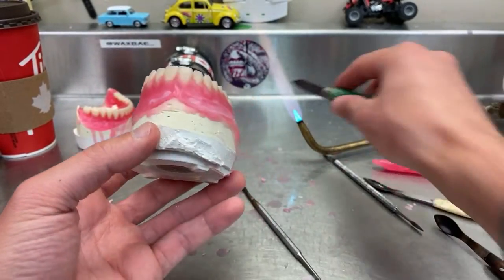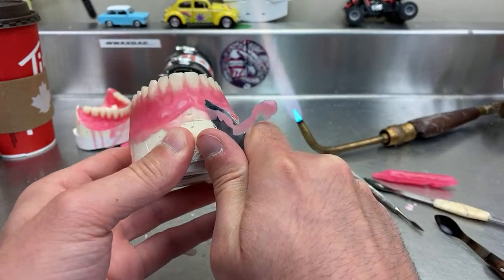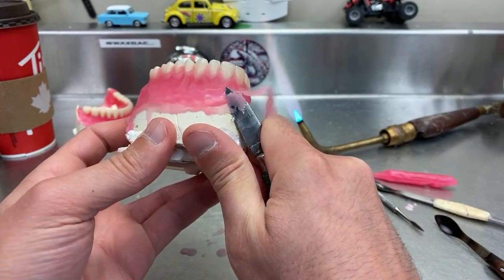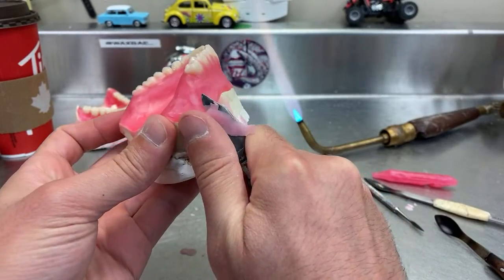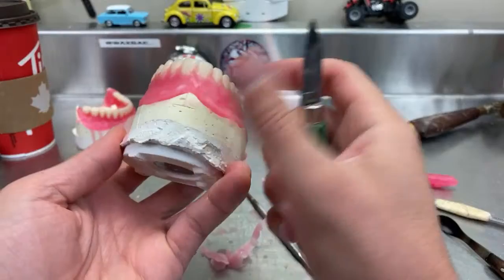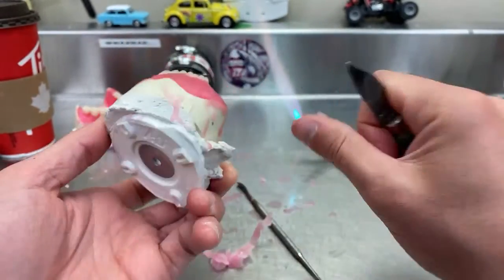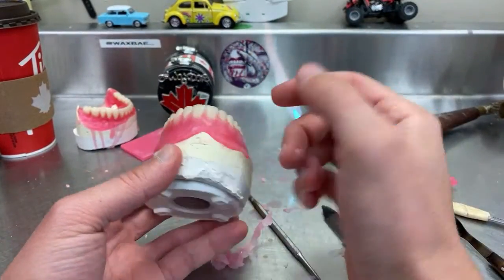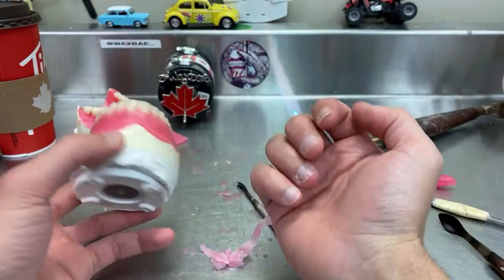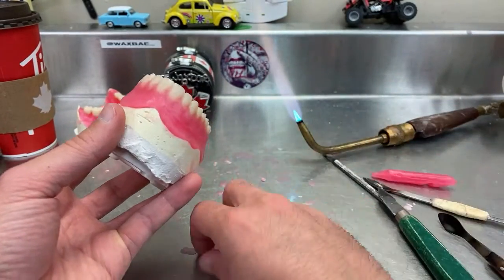Okay, so that's for that. Then we'll let it cool down a little and we'll start carving or festooning. So you have to kind of help yourself here by the way you add the wax, and that's how it's gonna help festooning later, because if it's all just like bulky wax here and you start carving it, it will be very, very hard on your hand, and that could, on the long term, cause damage to you.